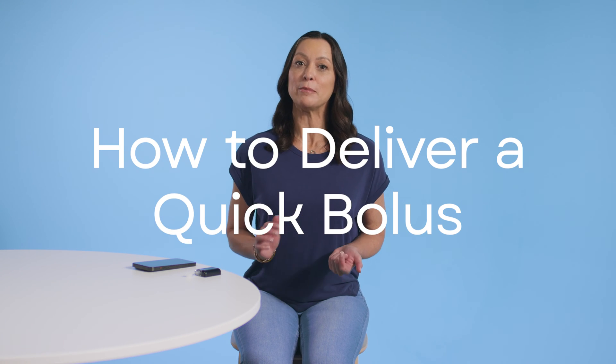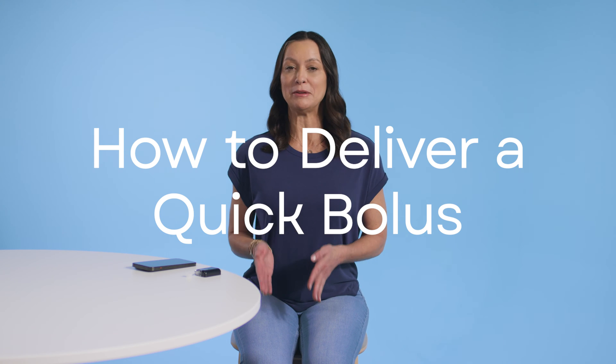Hi, I'm Christy with Tandem Diabetes Care. Today I'm going to show you how to deliver a quick bolus using the pump button on your Tandem Mobi insulin pump. This is a great feature in case you don't have your smartphone with you or if you've lost Bluetooth connection between your pump and smartphone.